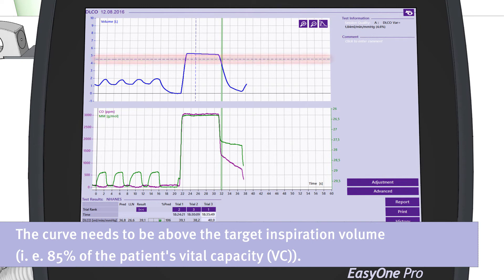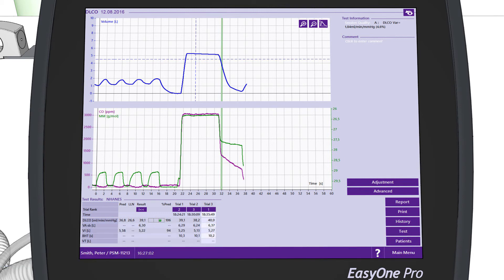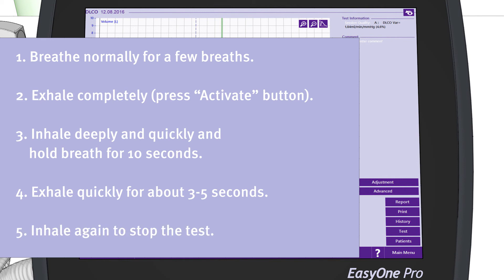The curve needs to be above the target inspiratory volume, which is 85% of the patient's vital capacity. The waiting time between trials is indicated on the display. After a minimum of two acceptable trials, the DLCO test is over. To summarize: tell the patient to breathe normally for a few breaths, then to exhale completely. Press the Activate button while the patient is exhaling. Tell the patient to inhale deeply and quickly and to hold the breath for ten seconds, then to exhale quickly for about three to five seconds, then to inhale again to stop the test.